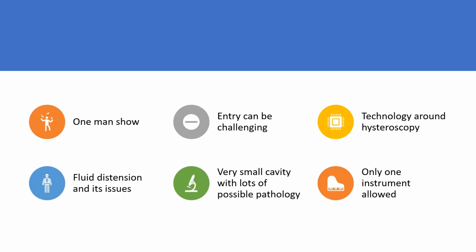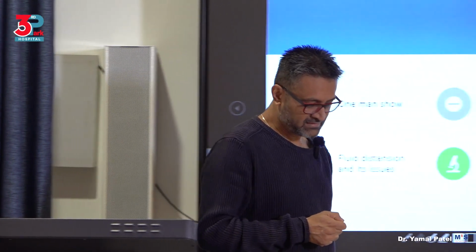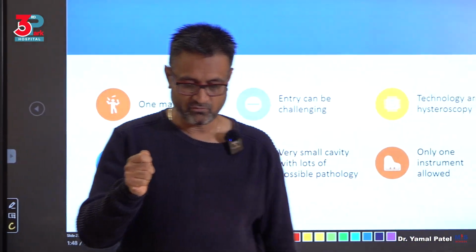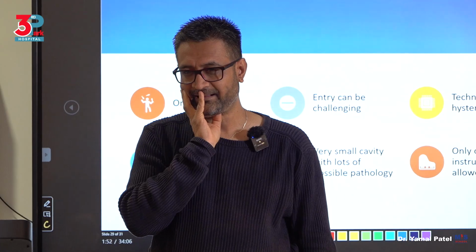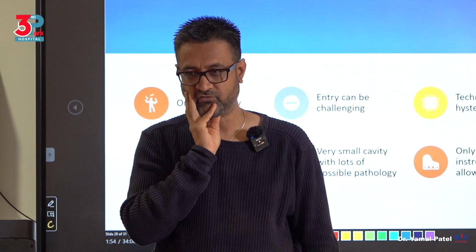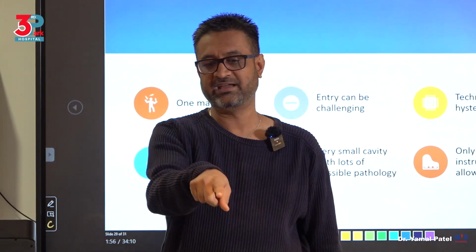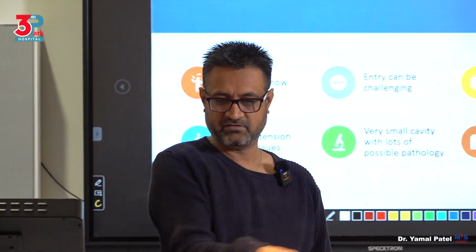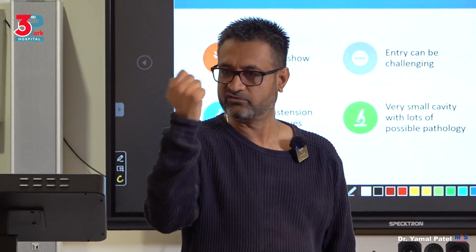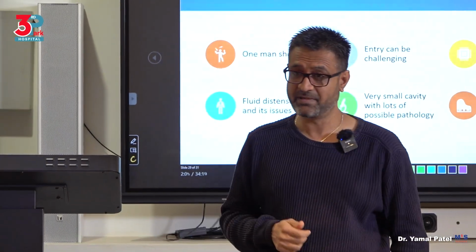And at any given time, usually you only play with one instrument at a time. So it's like trying to operate as a one-handed surgeon. In laparoscopy, I get a bit upset about anyone trying to do one-handed surgery. So you're trying to cut that and you're just pushing with that and cutting it. It's a one-handed sword type of surgery, very bad.